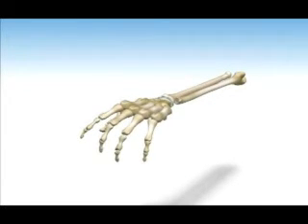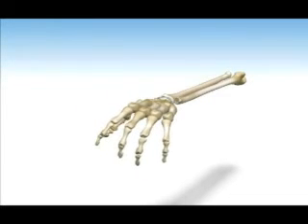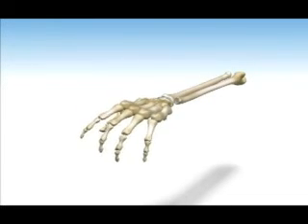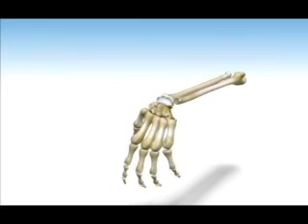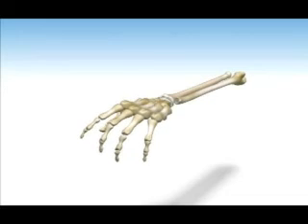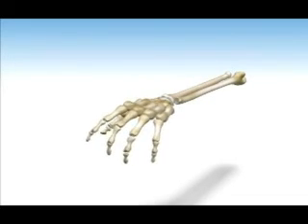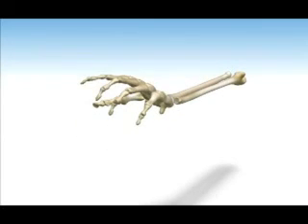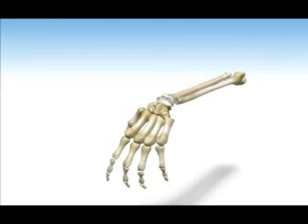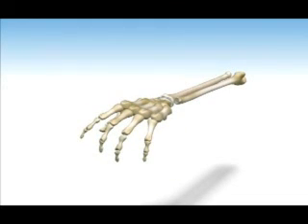Repair the dorsal capsule back to the soft tissue on the distal edge of the distal radius. If the capsule is thin at this area, reinforce the capsule with the distal half of the extensor retinaculum with non-resorbable 2-0 or 3-0 sutures. Repair the proximal portion of the extensor retinaculum over the extensor tendons in the usual fashion, without including the extensor pollicis longus tendon, which can be left extra retinacular to prevent tendon irritation or rupture.